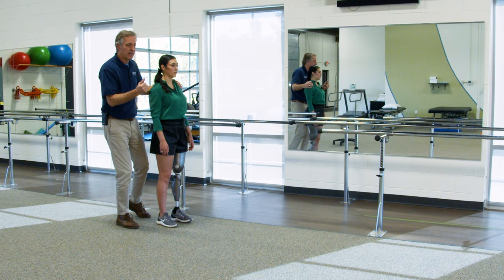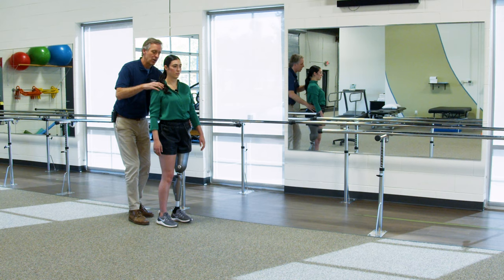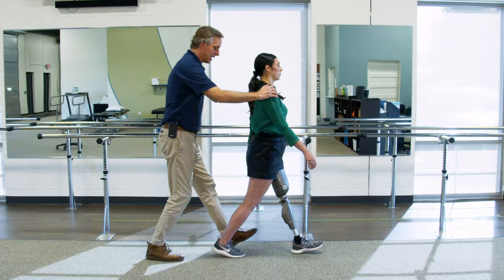But if I think, okay, Tracy's got it. She's got a lot of good weight on the prosthetic. She can drive that hip forward to initiate that step. I'm going to come up and help her with, say, all you think about is that powerful pelvis motion, and I'm going to help you with shoulder action. So just relax and go ahead and take a step. Good. And I'm just going to relax and help her get that shoulder action.